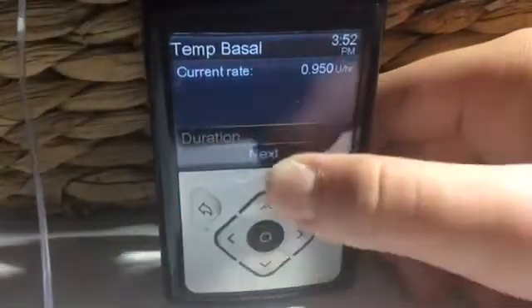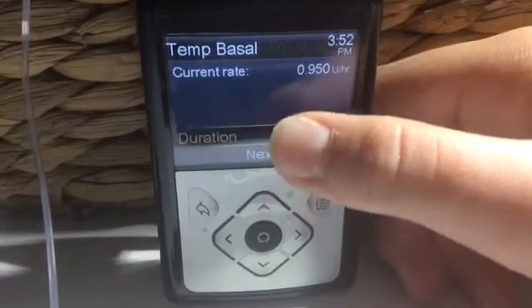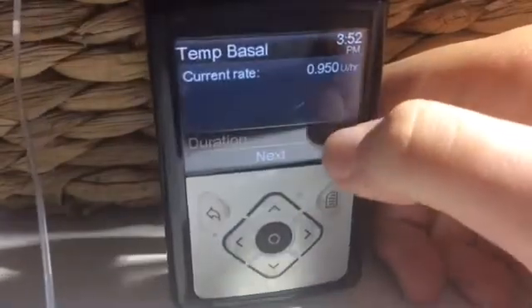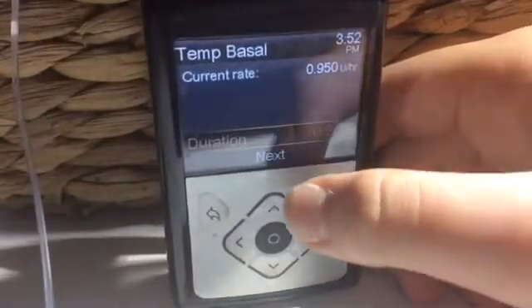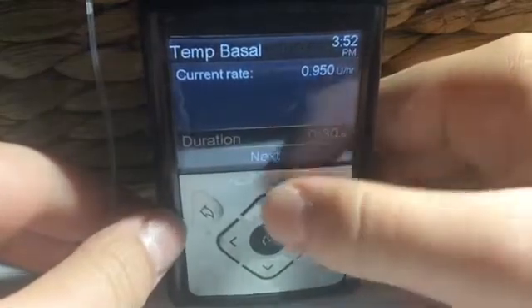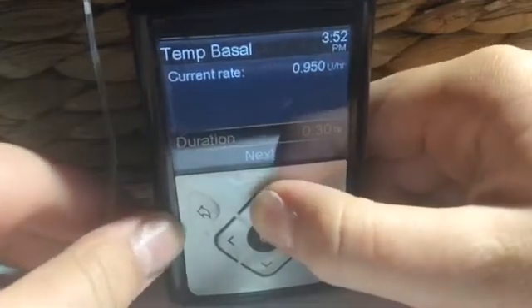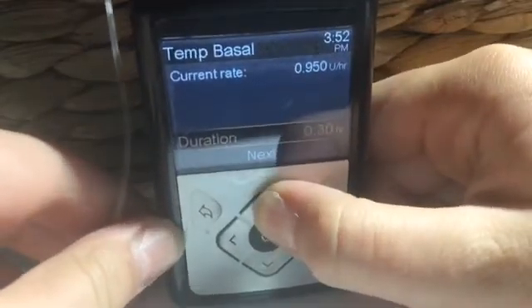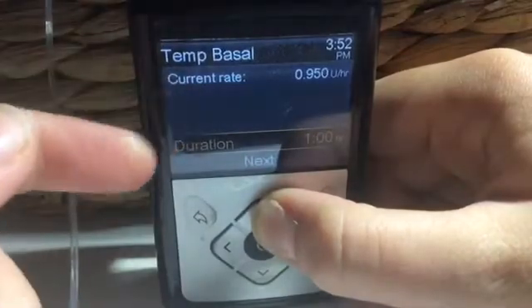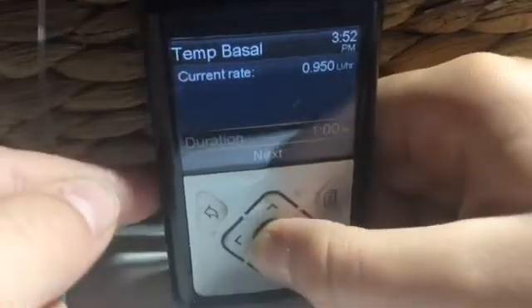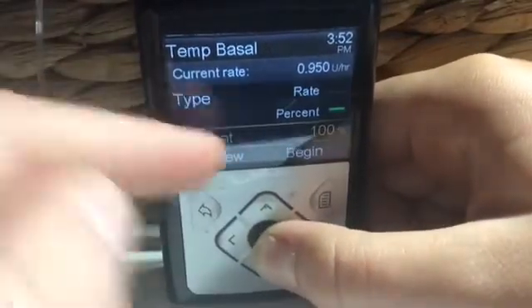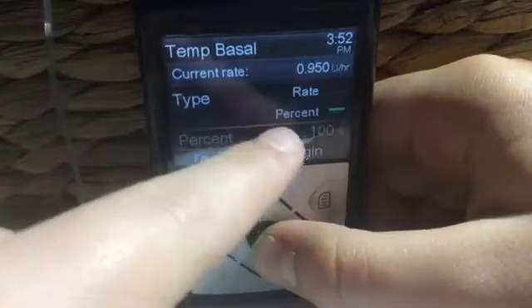The temp basal will give you extra insulin. So now I'll show you how it works. You type in the duration — for instance, let's say about half an hour, an hour, or 45 minutes, it doesn't really matter. I'm not sure what it goes up to but it's quite a bit.